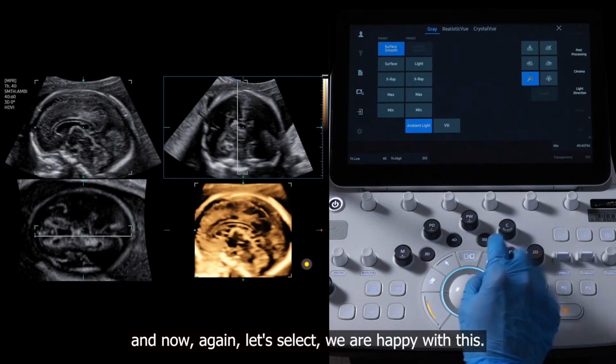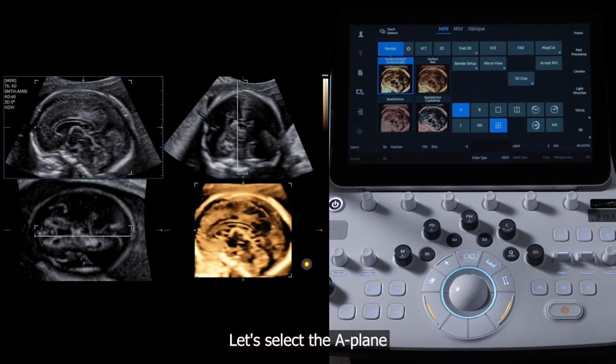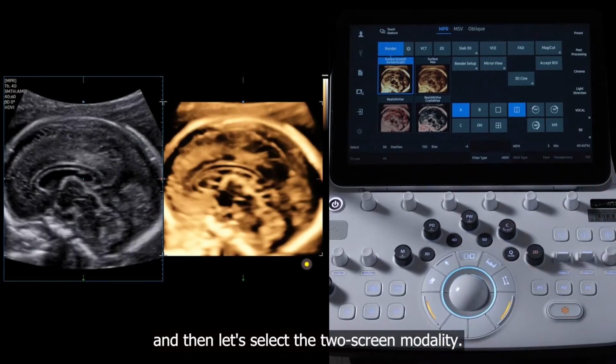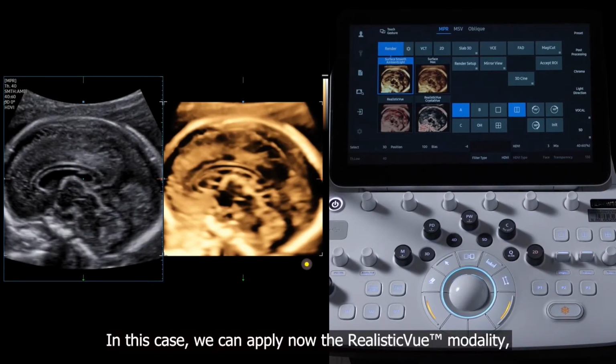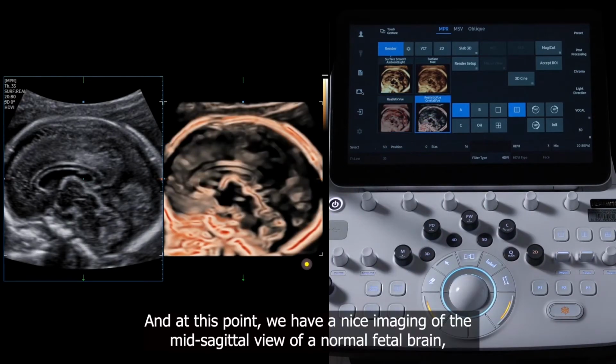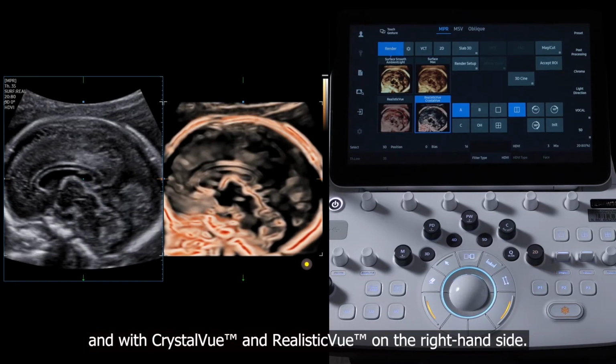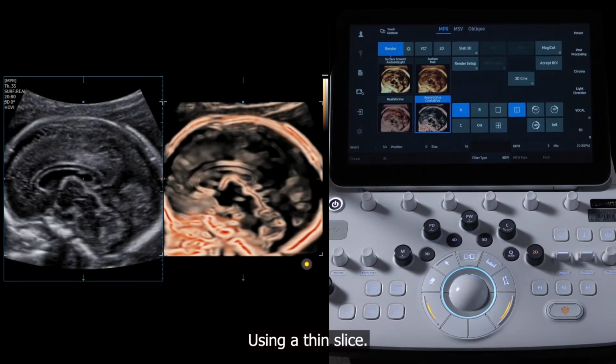And now, again, we are happy with this, let's select the A-plane and let's select the two-screen modality. In this case, we can apply now the RealisticVue modality together with the CrystalVue modality, and at this point we have a nice imaging of a mid-sagittal view of a normal fetal brain, which can be seen on multiplanar view on the left-hand side, and with CrystalVue and RealisticVue on the right-hand side using thin slice.